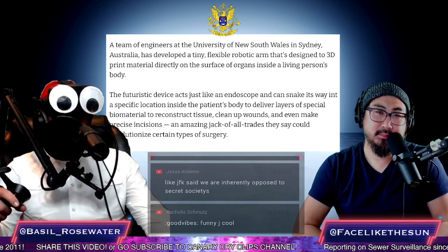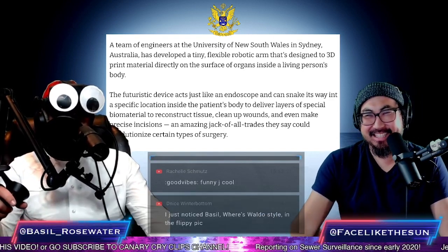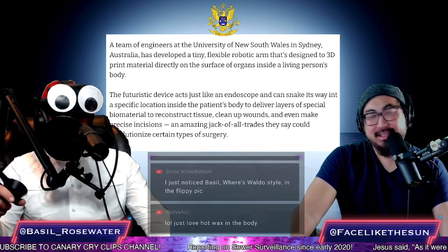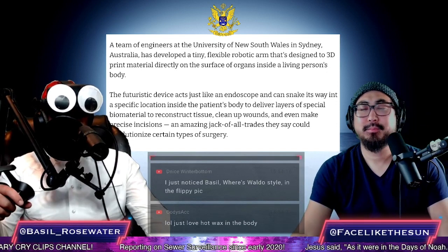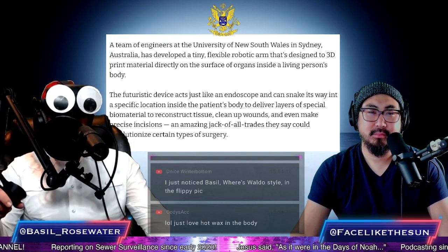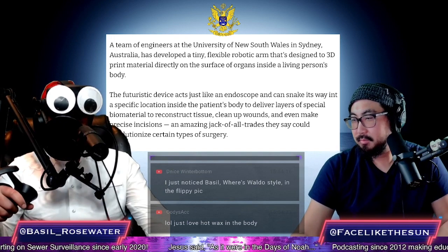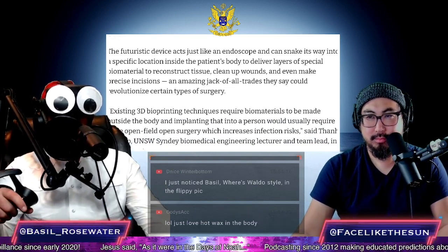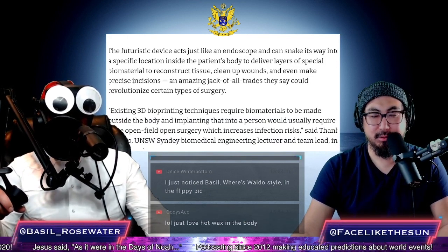A team of engineers at the University of New South Wales in Sydney, Australia, has developed a tiny, flexible robotic arm that's designed to 3D print material directly on the surface of organs inside a living person's body. Oh boy, it's about to be over. The futuristic device acts just like an endoscope and can snake its way into a specific location. Don't you love it? Robots snaking their way. What could go wrong?